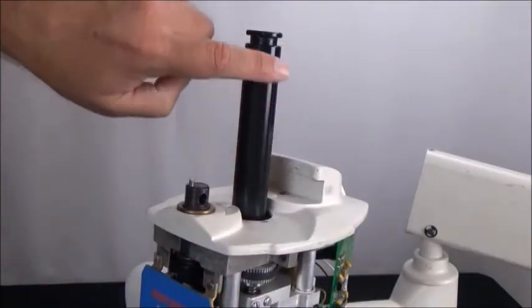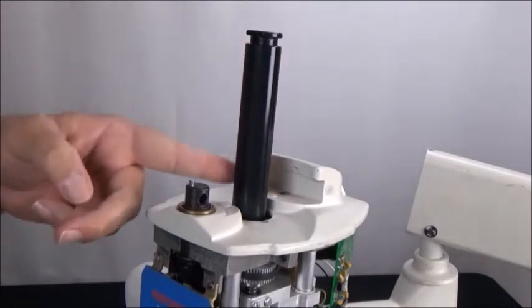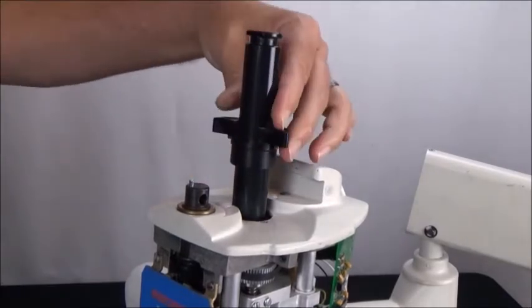Apply a small amount of dielectric grease to the piston. Reinstall the winged oil seal.